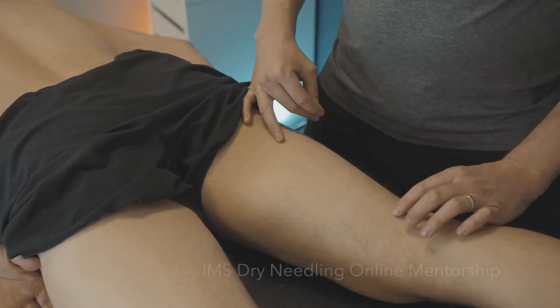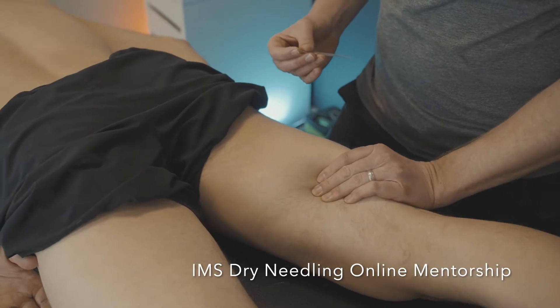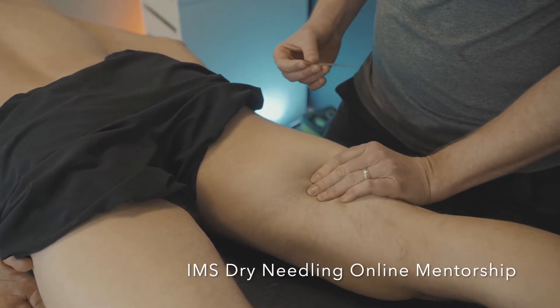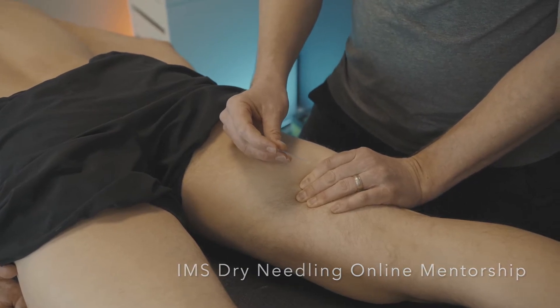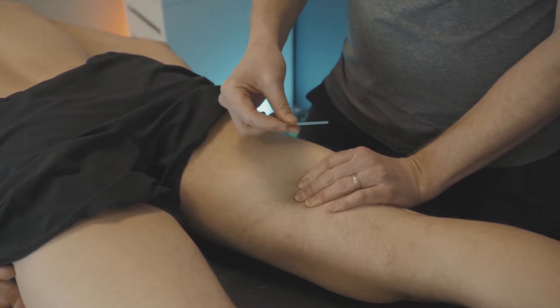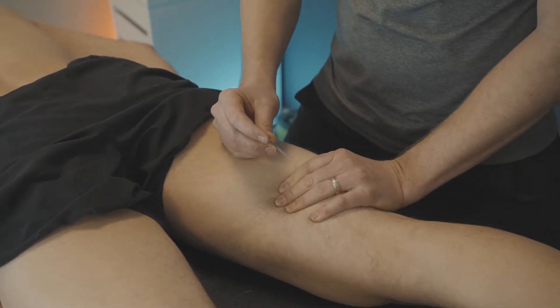If I'm going to treat more of the lateral hamstrings, I will take my hand and grab a whole bunch of the muscle and just sort of pull it towards me a little bit. Then with the needle, I'm angling back towards me and away from the midline, so my chances of hitting that sciatic nerve are much less.